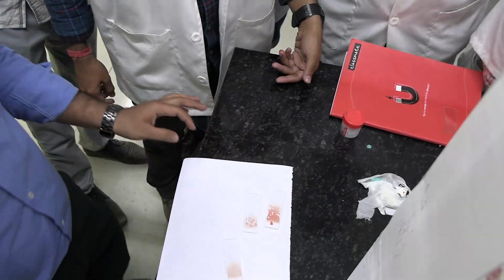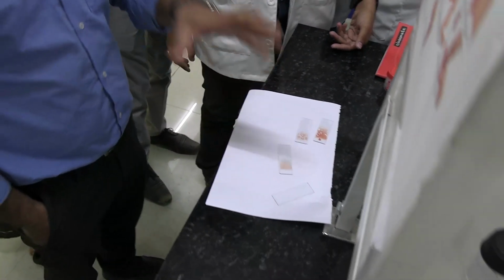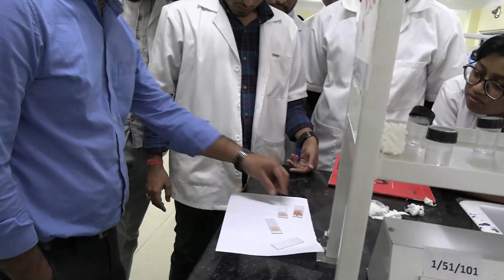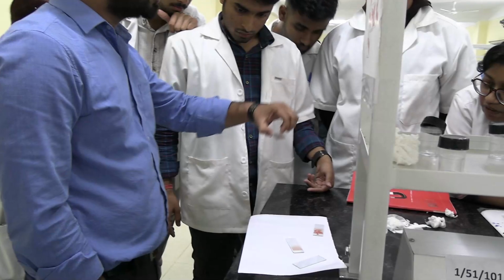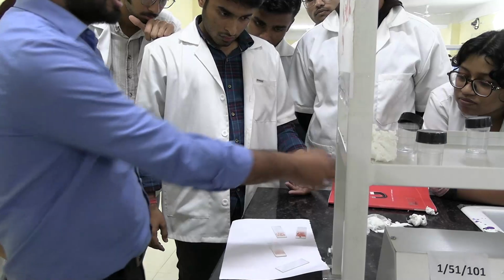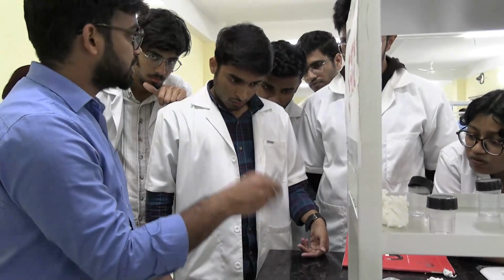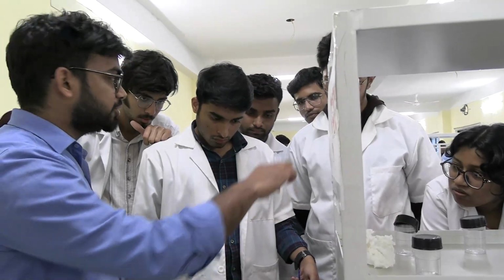See the difference? Here it is too much blood. Here it is a bit less blood. So suppose this was perfect blood, but the smear is not perfect here. Why? Bubbles are here. The slide was not cleaned properly. Maybe we were using the tissues, and the tissue also has some impurities. Those bubbles. See here there are no bubbles. It is clean properly. You have cleaned this now.